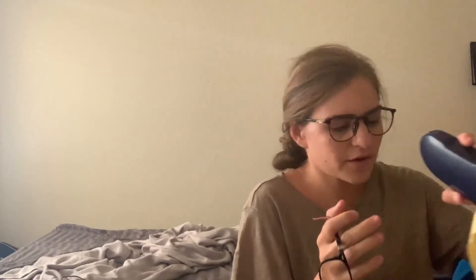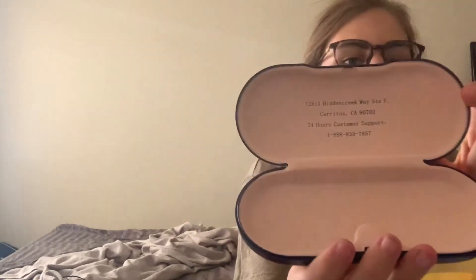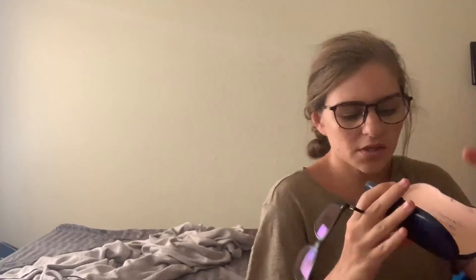The glasses do come in the same Goggles for You plastic case, which is good for kids because you can drop it and it won't break. It has their address and customer service number on it.